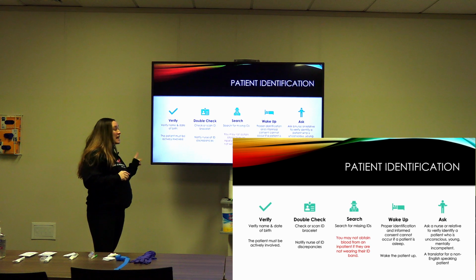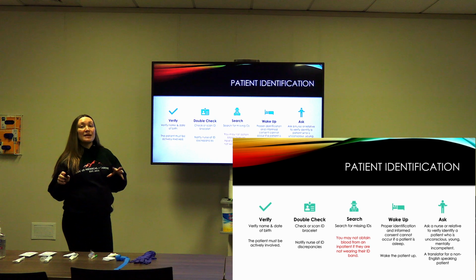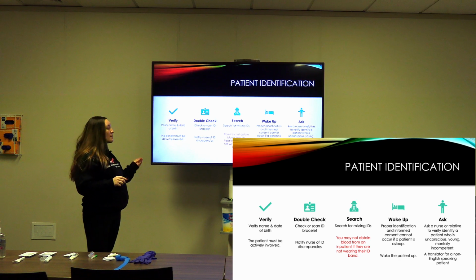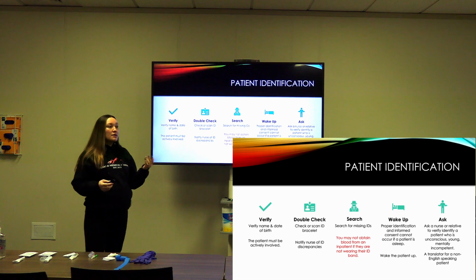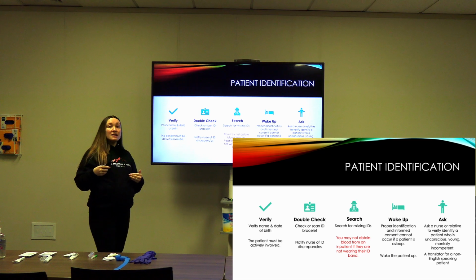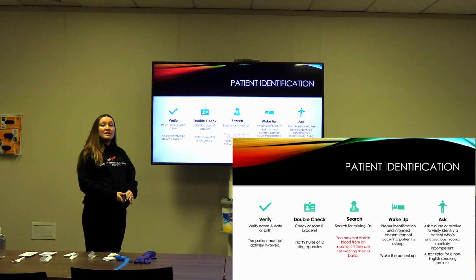Verify name and date of birth. This is happening with every patient, every single patient. First, last name, date of birth, every time. The patient must be actively involved in this, which means they are calling in response to you. Okay? You ask them, what's your first and last name and date of birth? They tell you, you verify it based on what you see. Great. Double check. Then you scan or check their ID bracelet.